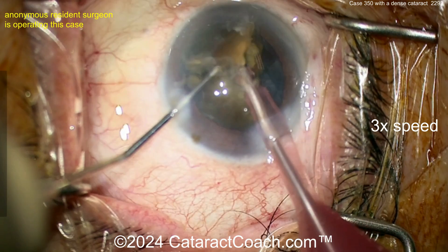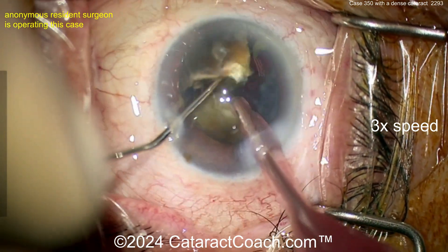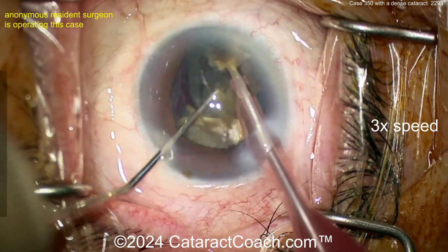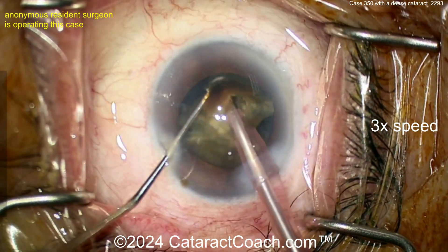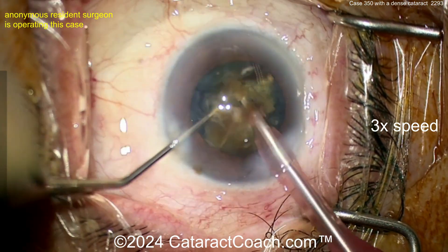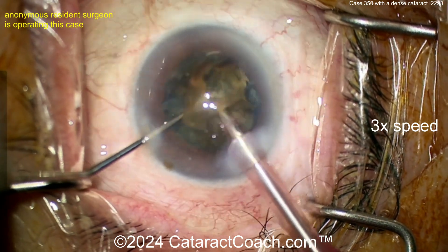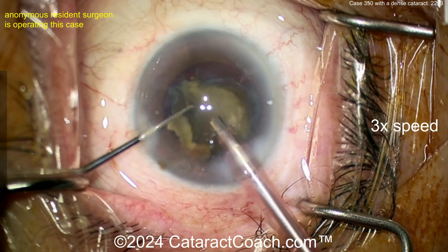There's a whole 10-part series on CataractCoach to teach you all this. Now splitting those pieces again — that fibrous plate makes it tough. You can tilt up that piece and sub-chop it again. Great work with the chopper, by the way. Also, your draping looks good — eye in primary position, a couple of straight lashes I won't bother with. I appreciate the effort keeping the eye in primary position the whole case, and the microscope is actually focused.